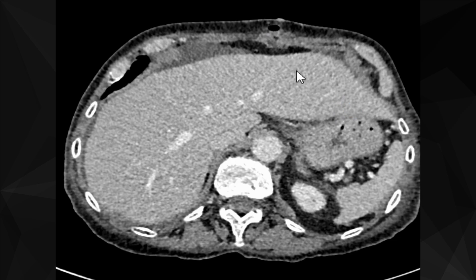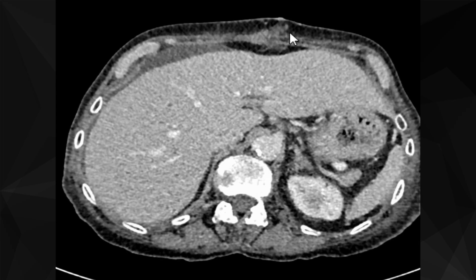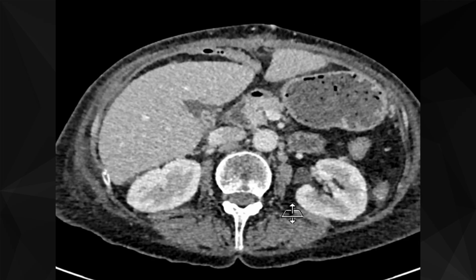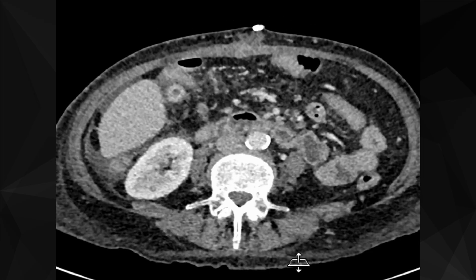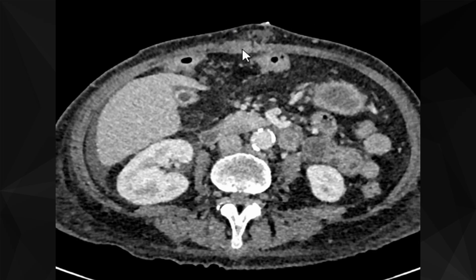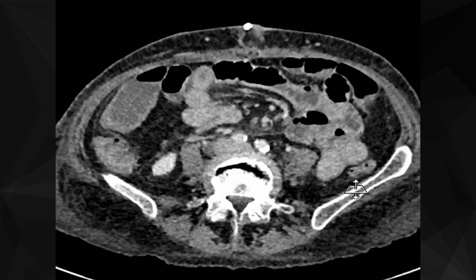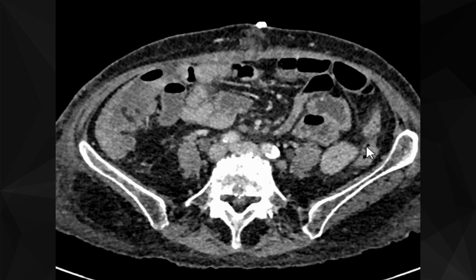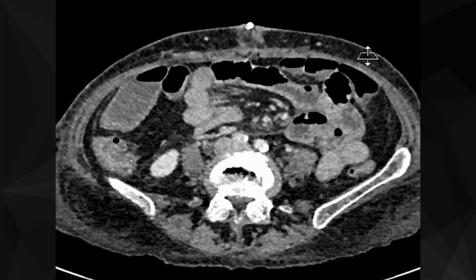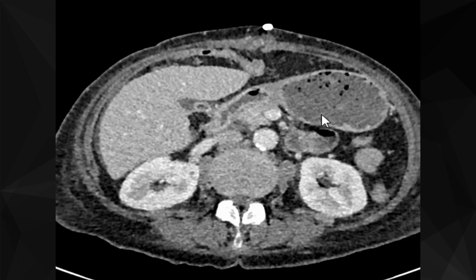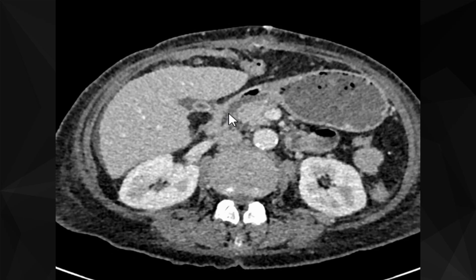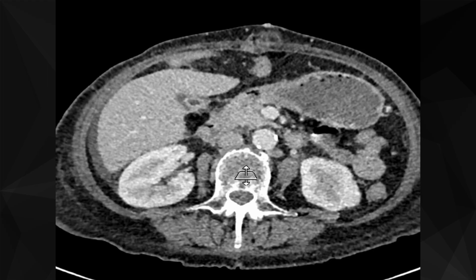There is some fat stranding in the anterior abdominal wall, which is again an expected post-surgical finding. There is also a bit of haziness in the omentum and mesentery — all post-surgical. Now let's return to the site of perforation. Again, you can see the stomach, D1, and then this is D2.